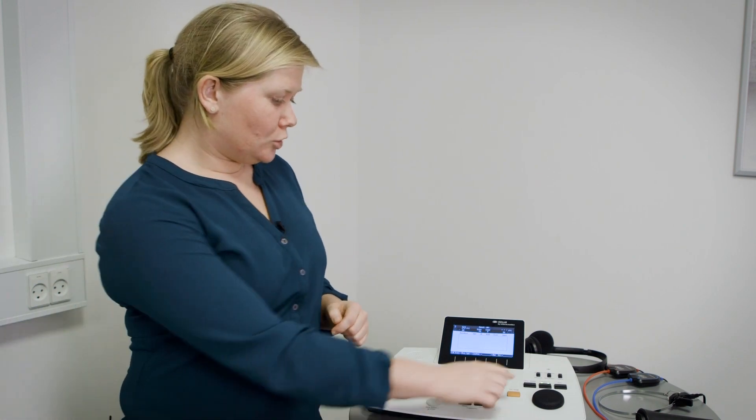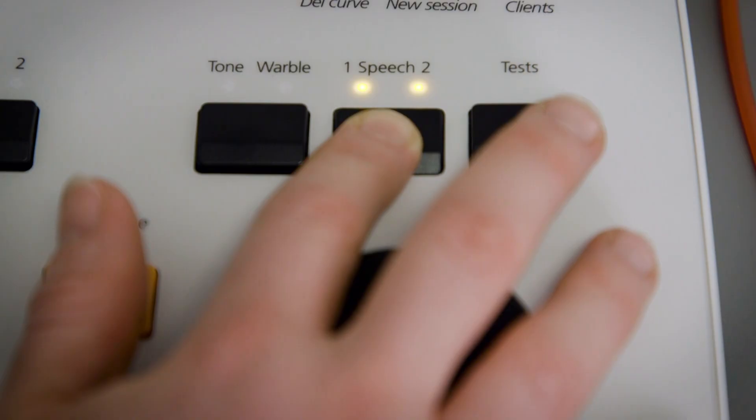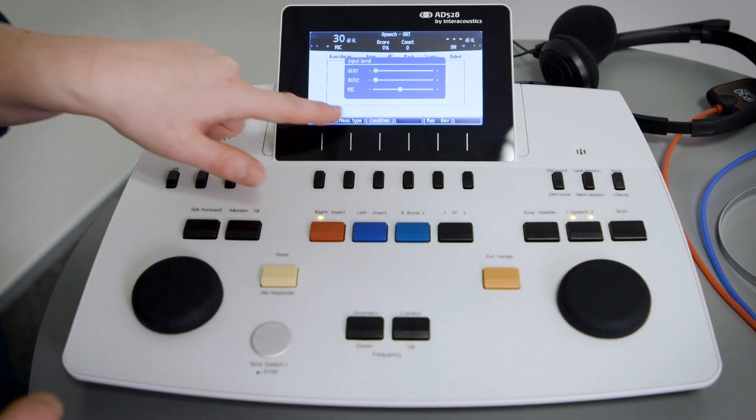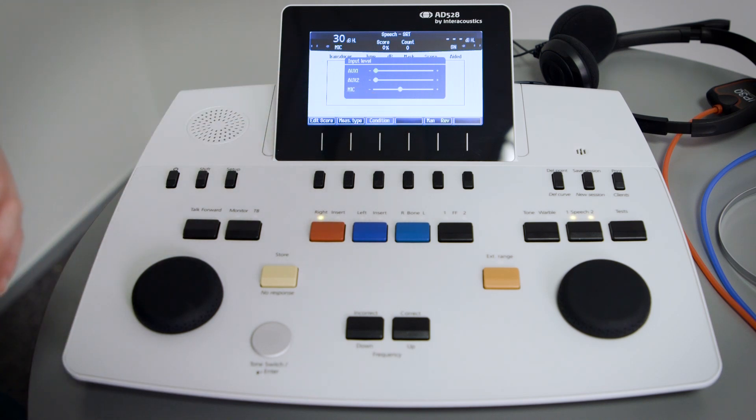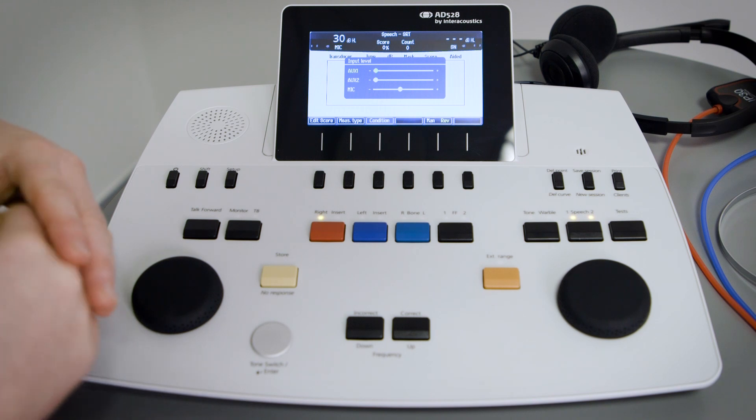That is done by long pressing again here on speech while you are in the mic or the AUX, together with the shift key, and you then have an overview of the channels and calibrate in accordance with the level so that you have an accurate level of the output that you send to the patient. That is something you need to do the first time you set up the device with the mic and the monitor headset that you use.